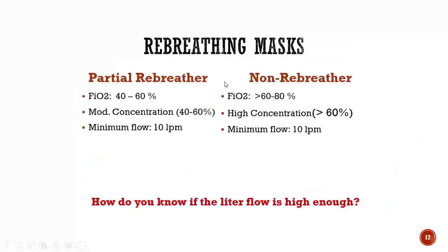You also have your partial rebreather and non-rebreather. These are the other low flow devices that we are going to be talking about. There's another PowerPoint where there's pictures of this that we can talk through. We're going to talk through these right away when you guys come into class. This is where the hands-on stuff gets to be very, very helpful. Big takeaway is you guys are responsible for all the percentages, all the liter flows, which are on that grid all together in one spot.